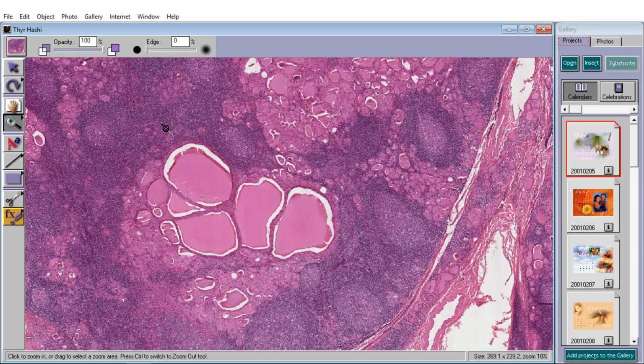It also goes by another name, named after a famous Japanese doctor, Dr. Hashimoto. So probably in the literature today, you're more likely to see the term autoimmune thyroiditis rather than Hashimoto, but they're the same disease. And how do you make the diagnosis of Hashimoto or autoimmune thyroiditis?